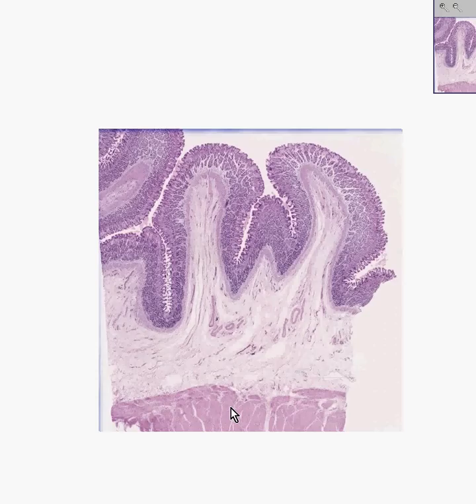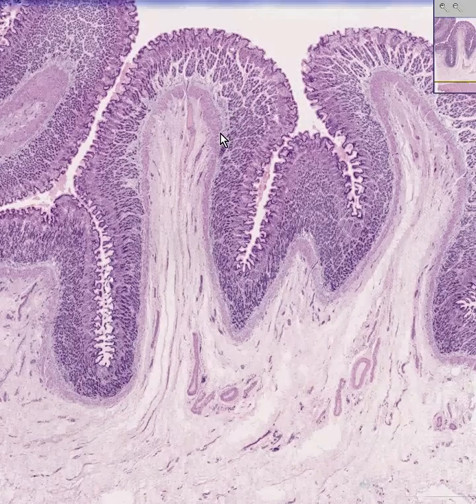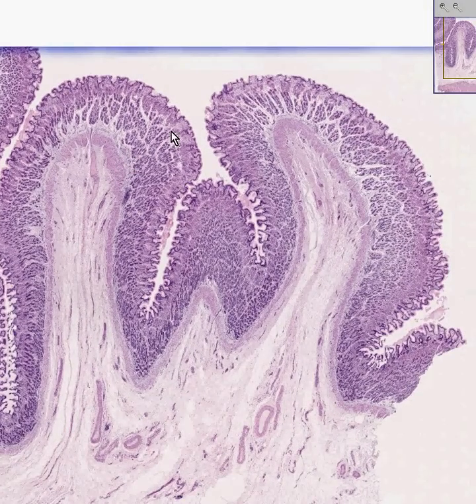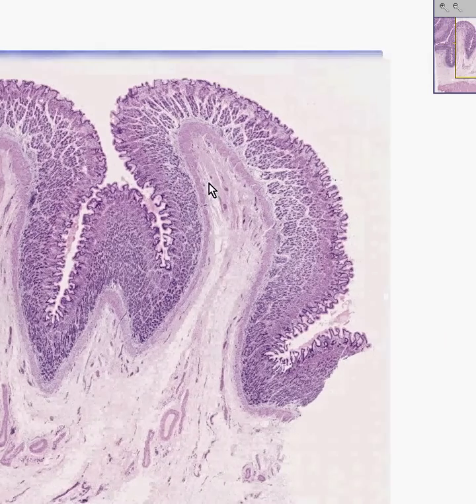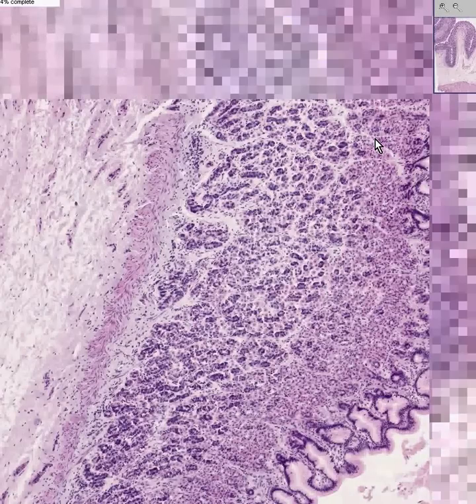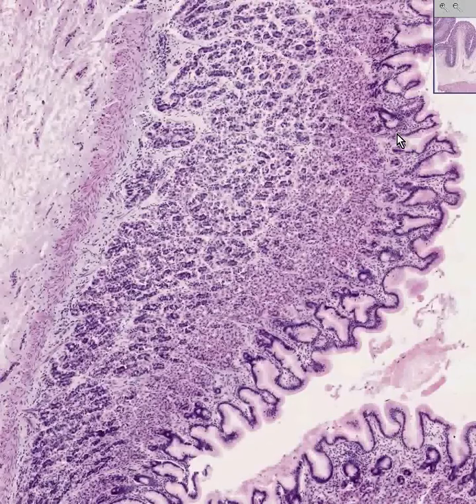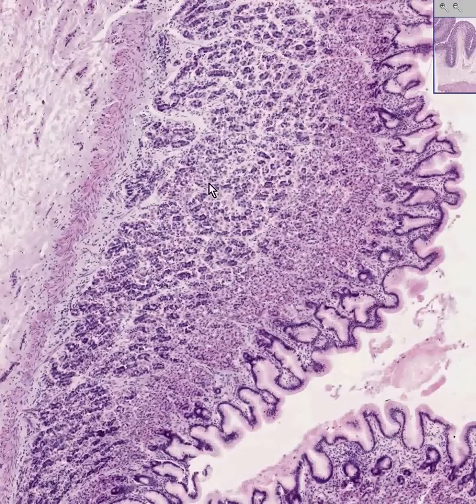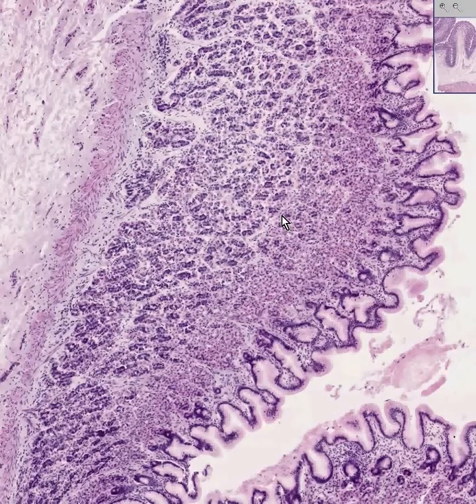What you don't see in this particular slice is the full thickness of the smooth muscle wall or the serosa, but we've already seen that many times. Let's look at the mucosa. This is a section of the fundus of the stomach — the fundus is a region very active in acid secretion. We can see that the surface epithelium is not arranged in a beautiful well-defined papillary array like the small intestine, but instead the glands pit down into the mucosa rather than grow up like little fingers. That's why these are called gastric pits.